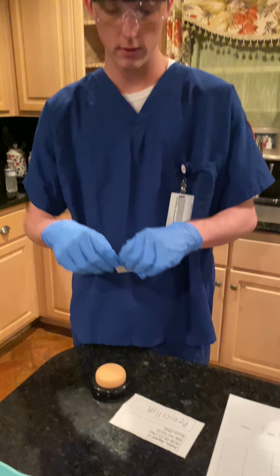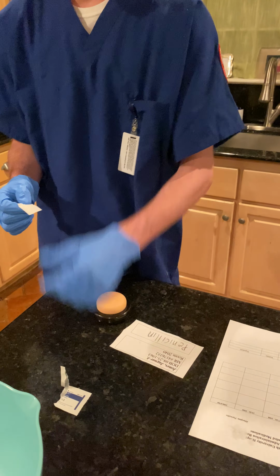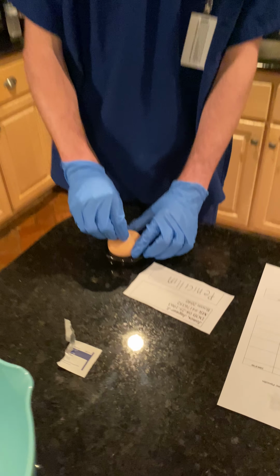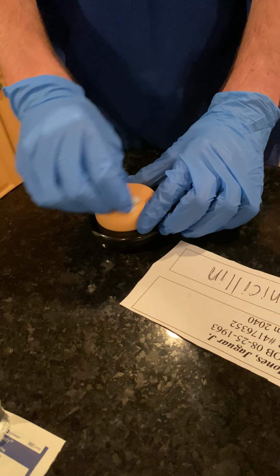And I will clean the area that I will be giving the injection in and check for any bruising and the integrity of the skin or muscle. So when I'm cleaning, I will start from the inside in a circular motion and work my way out.